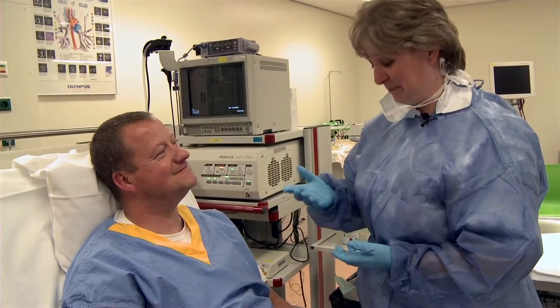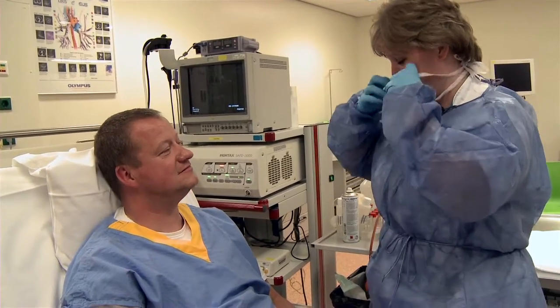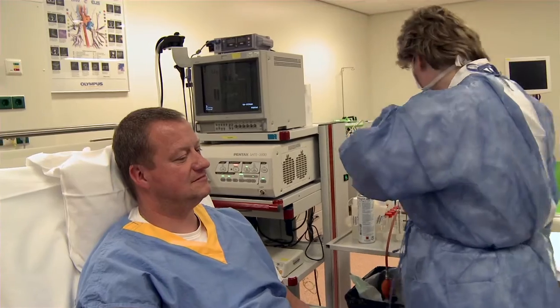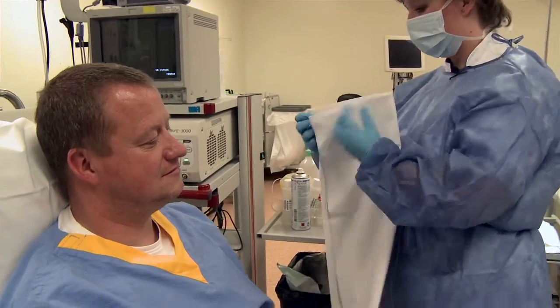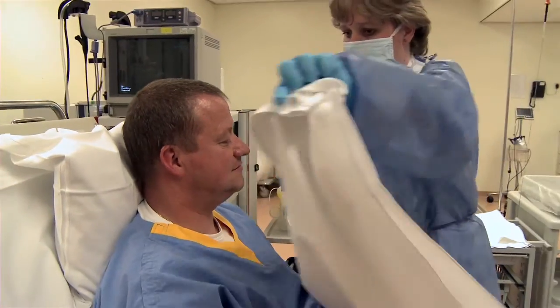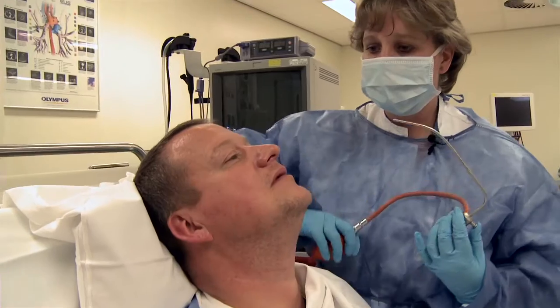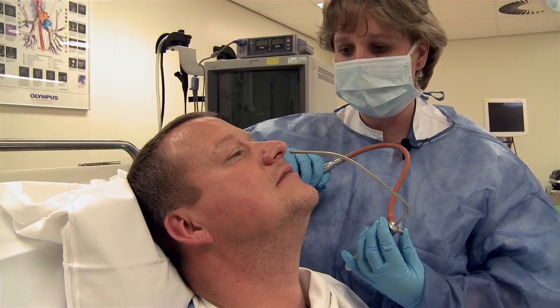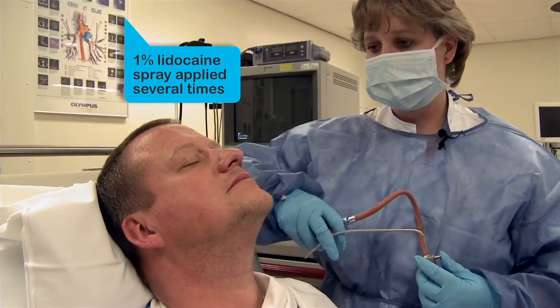Once at ease, the nurse checks whether the patient has any removable dentures. A face mask is always worn because the patient can cough during the procedure. A towel is placed on the patient to prevent soiling. The patient's head is tilted slightly backwards, and with a nebulizer, the nurse gently applies a 1% lidocaine solution to the nose several times.